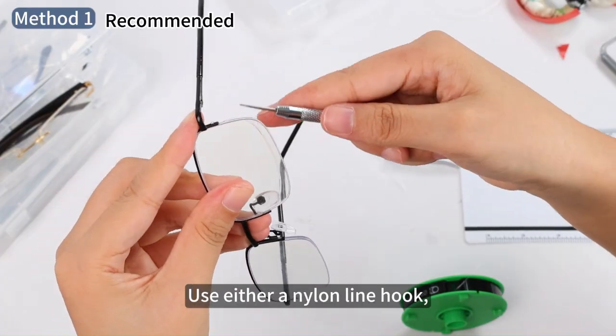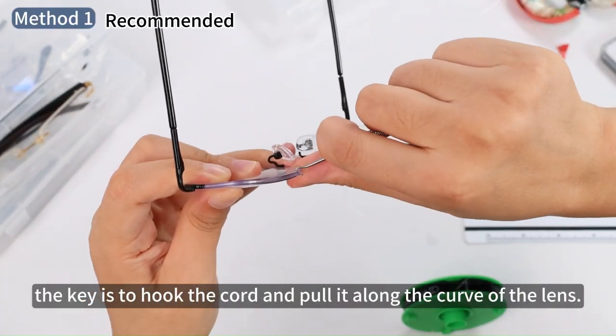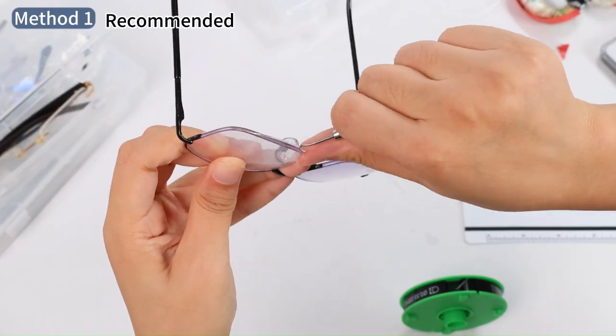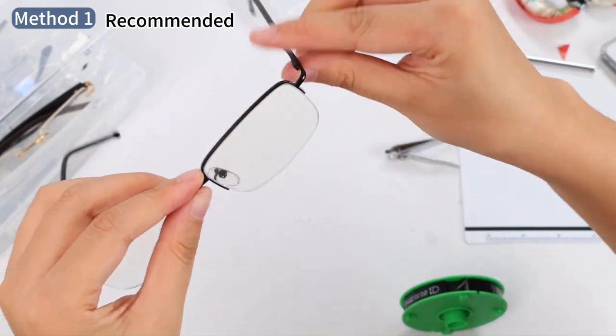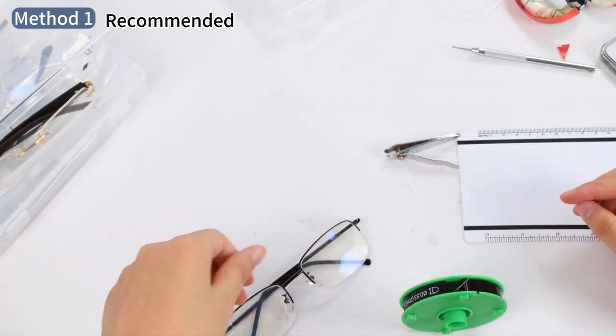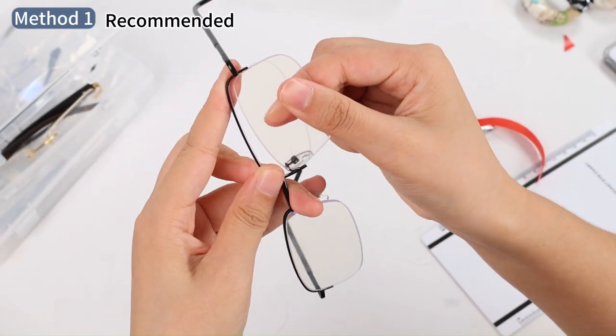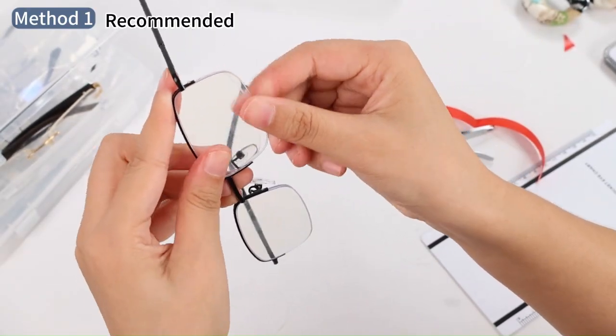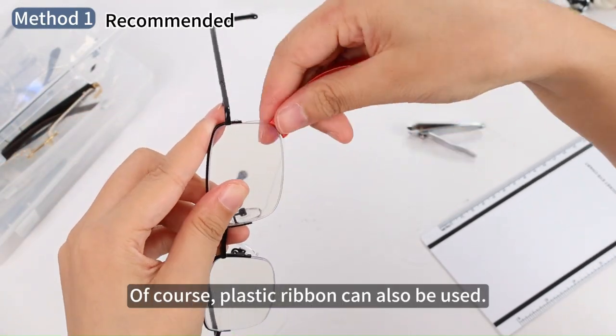Use either a nylon line hook. The key is to hook the cord and pull it along the curve of the lens. Of course, a plastic ribbon can also be used.